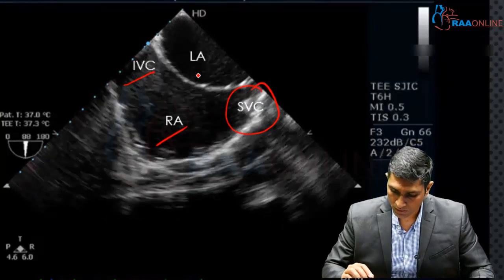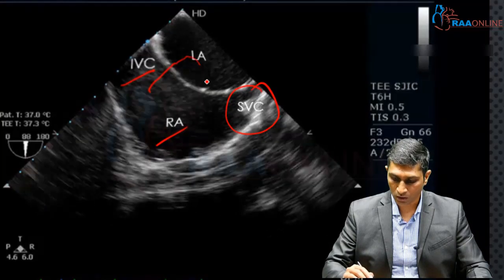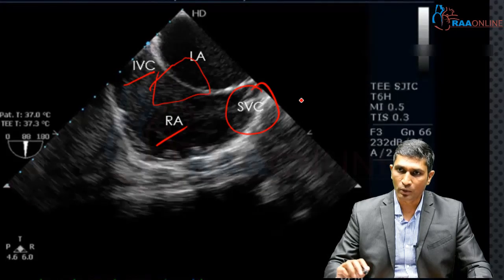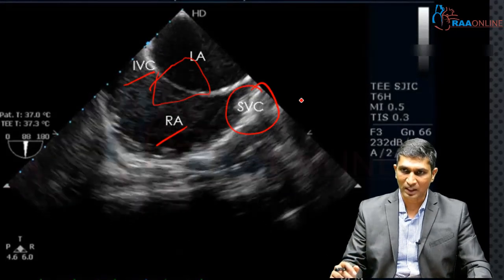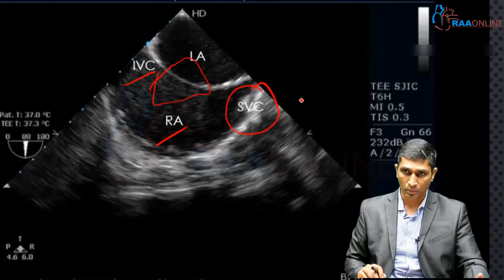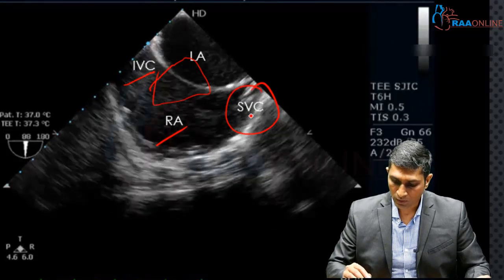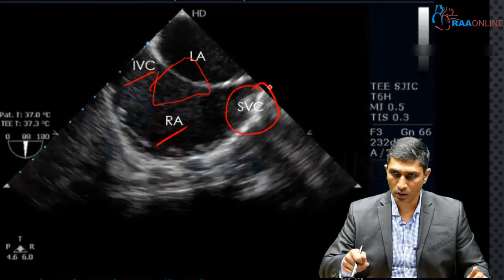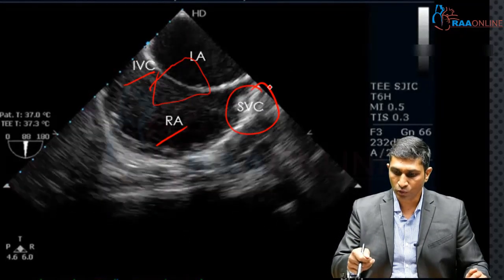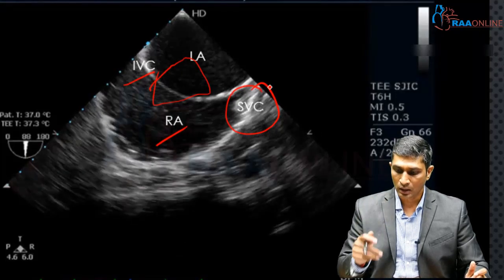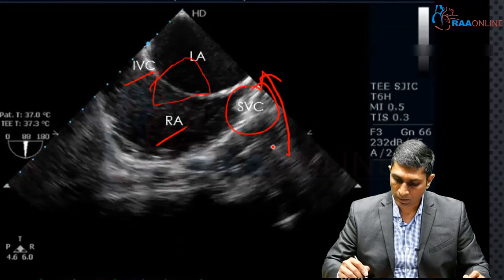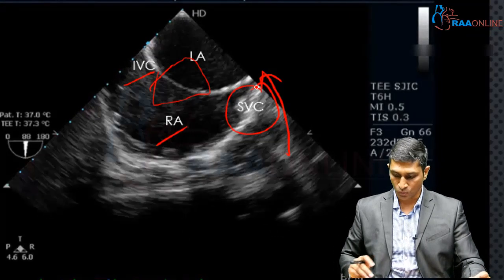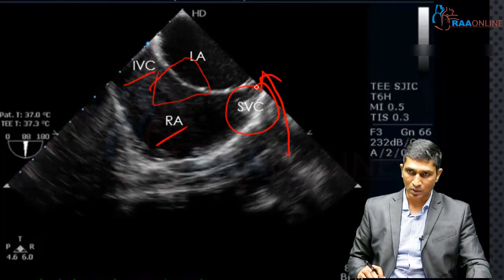For atrial septal defects, Doppler interrogation across the interatrial septum with the Nyquist limit decreased to around 20 will visualize the patent foramen ovale or any ASDs — ostium secundum ASDs can be visualized here. When you want to visualize more of the SVC, you withdraw the probe because the SVC is more cranial. Sinus venosus ASDs draining into the SVC are also best visualized from this view.